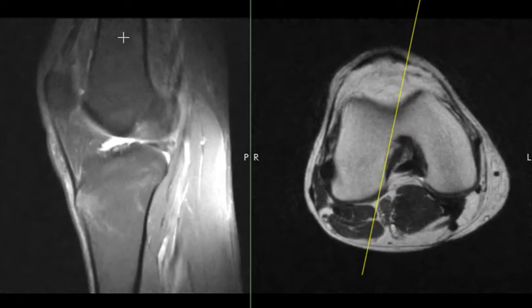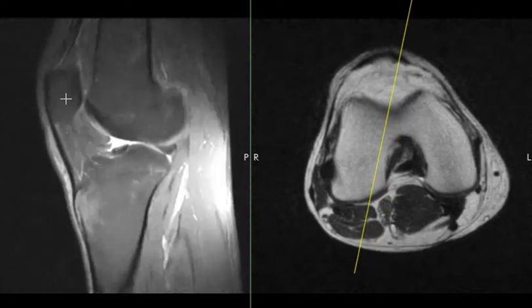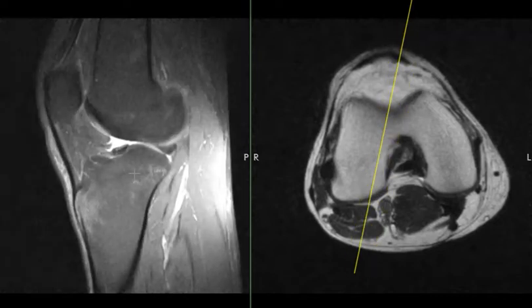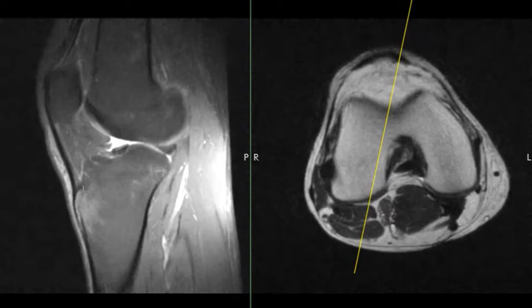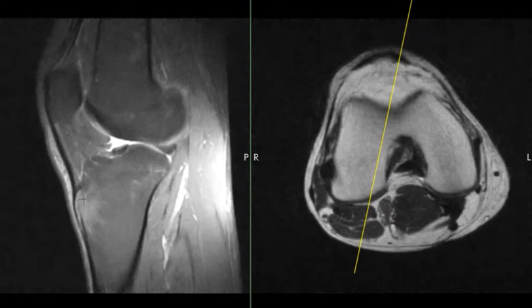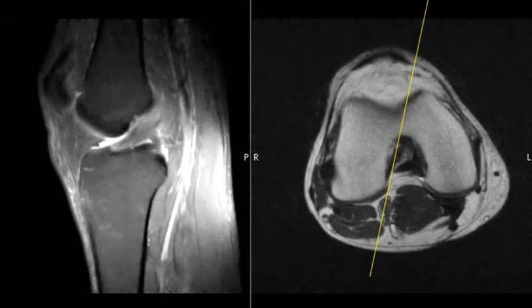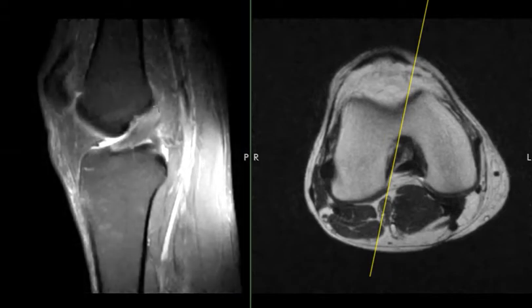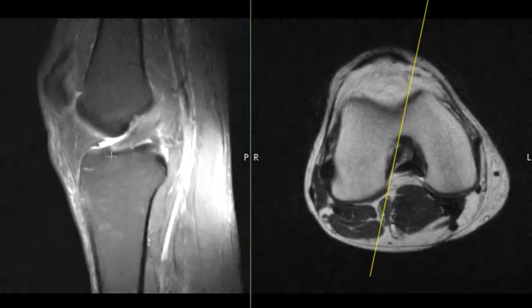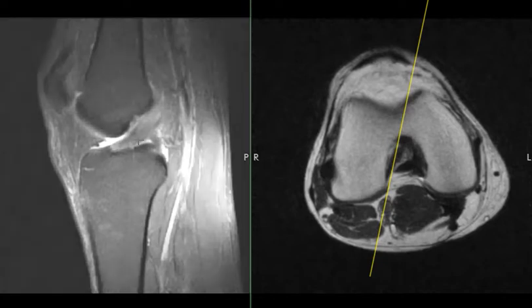We see the femur up high here. We see the kneecap in the front. We just did a limited examination on him in the original one. He has a little bit of bone marrow edema here with the patellar tendon attachments. He had an injury here, and the ACL comes obliquely from the back of the femur to the front of the tibia. Here's the tibia. So this is the ACL.